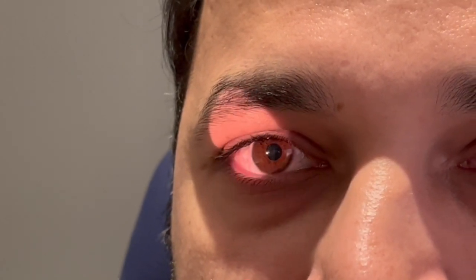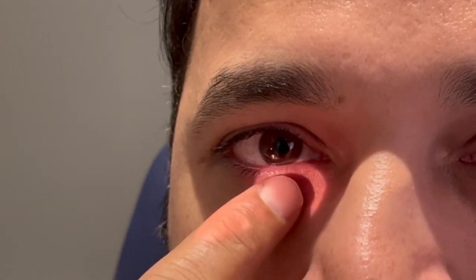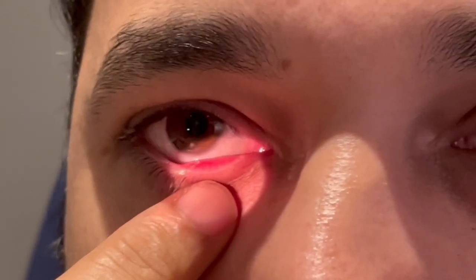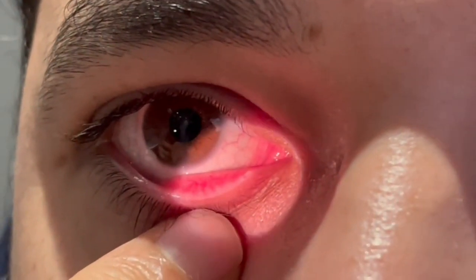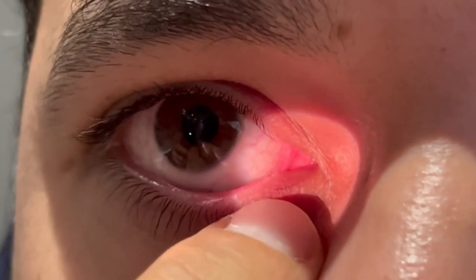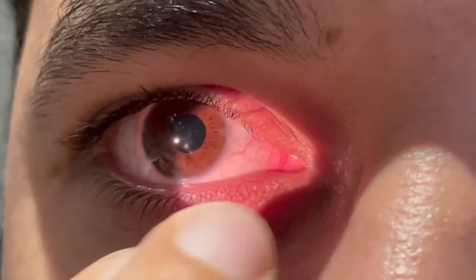If the lid margin is not rolling, that means it is working perfectly fine. Then we are going to slightly pull the lid up to see the lacrimal punctum — that is the area you see here, and that is the lacrimal punctum.